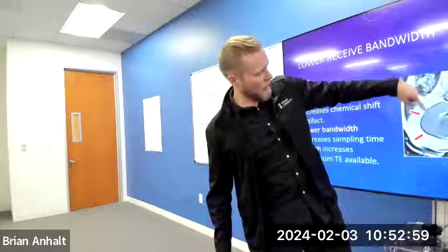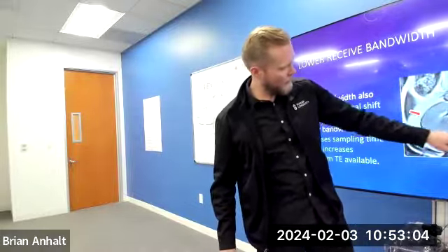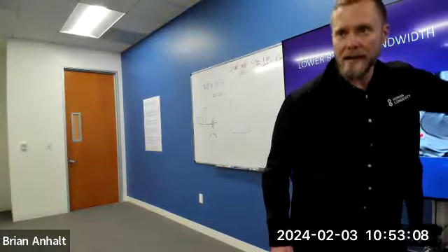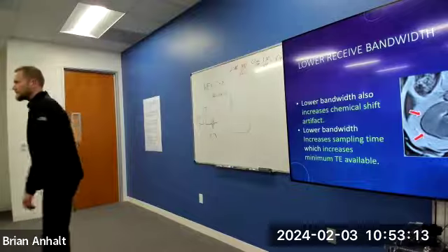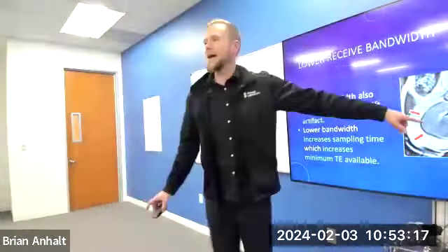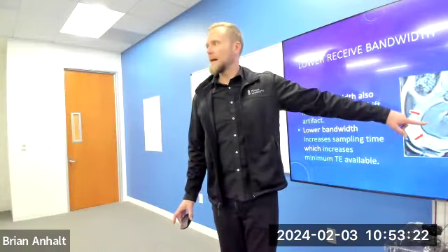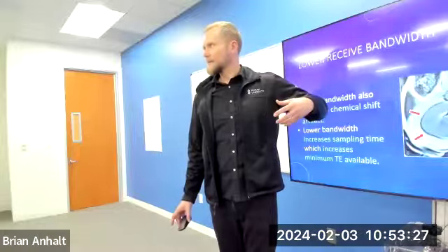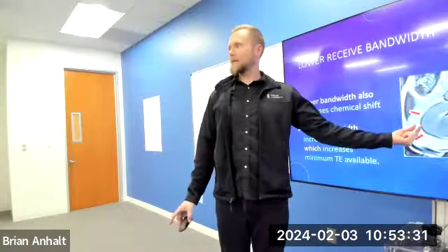So you notice this little dark line right here on the kidney, and then it's bright on this side, artificially bright here, and then the same thing here, dark on this side, artificially bright right here. That is an artifact. That doesn't really exist in the body. That is called chemical shift. Low bandwidth makes this artifact worse. I'm not expecting you to visualize why yet, but just know this. A high bandwidth is going to make this artifact better.